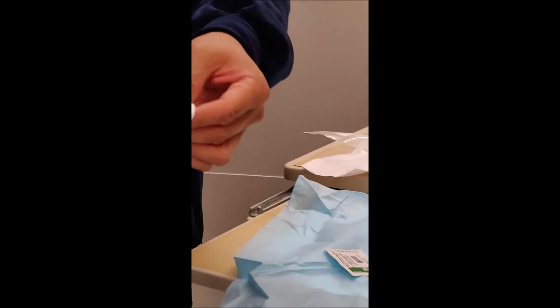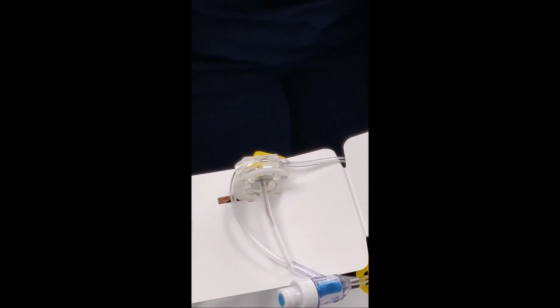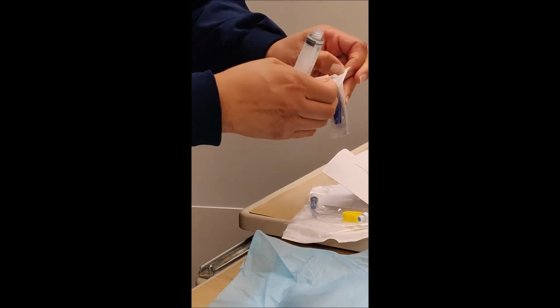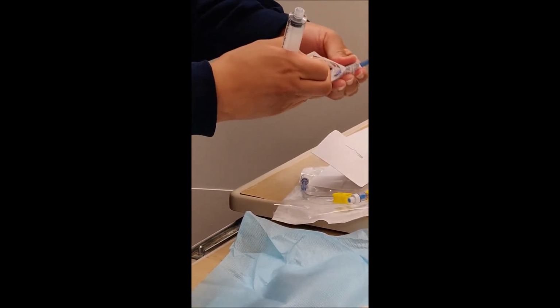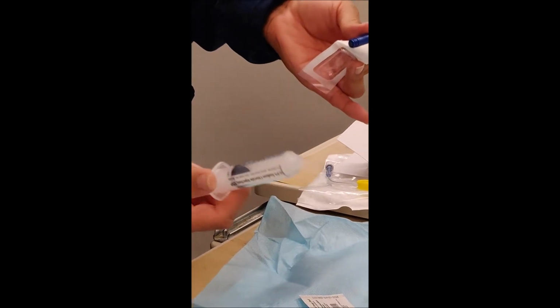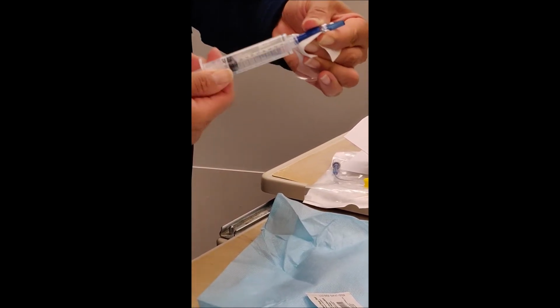So when you take off the needle, you'll see that the needle is right there. You will make sure that everything is nicely primed. So we would connect our saline flush to the cap.